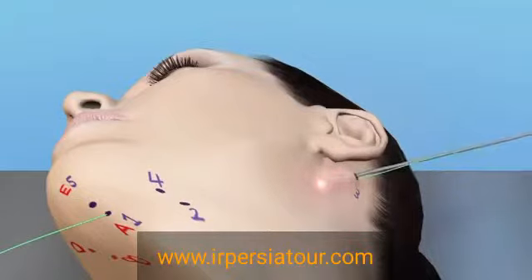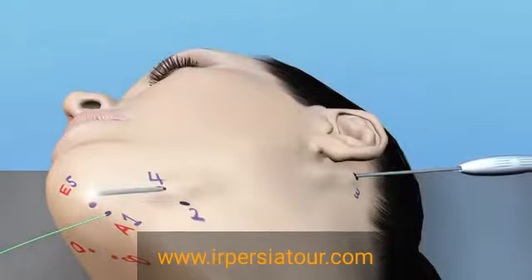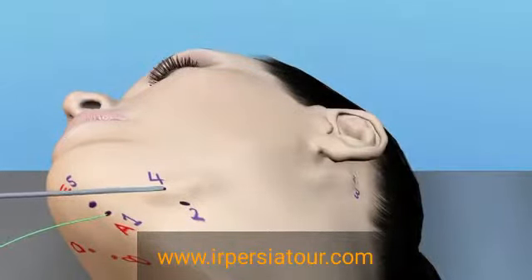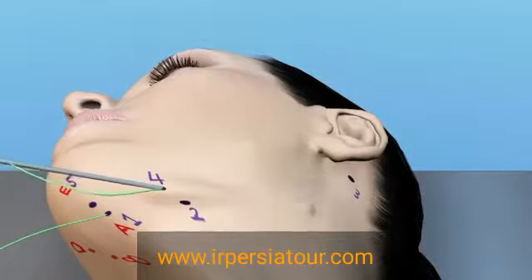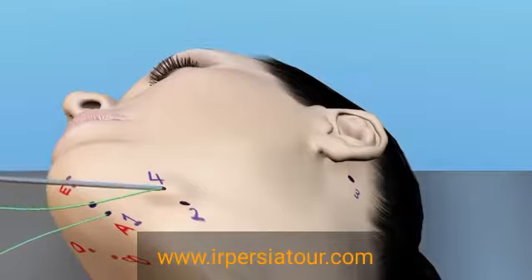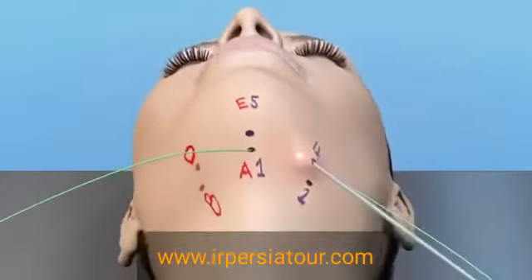The rod is then brought up so that it will encircle the ligamentous attachments in the mastoid area, and then directed downward to point 4, where it is brought out. The ligaments in the mastoid fascia are quite formidable and will anchor the suture and allow this to elevate the structures at the posterior aspect of the neck.